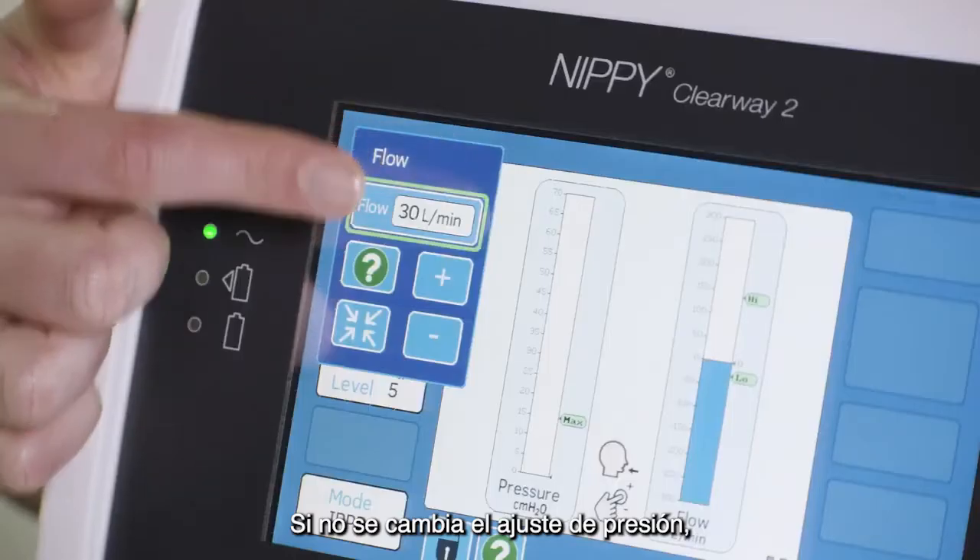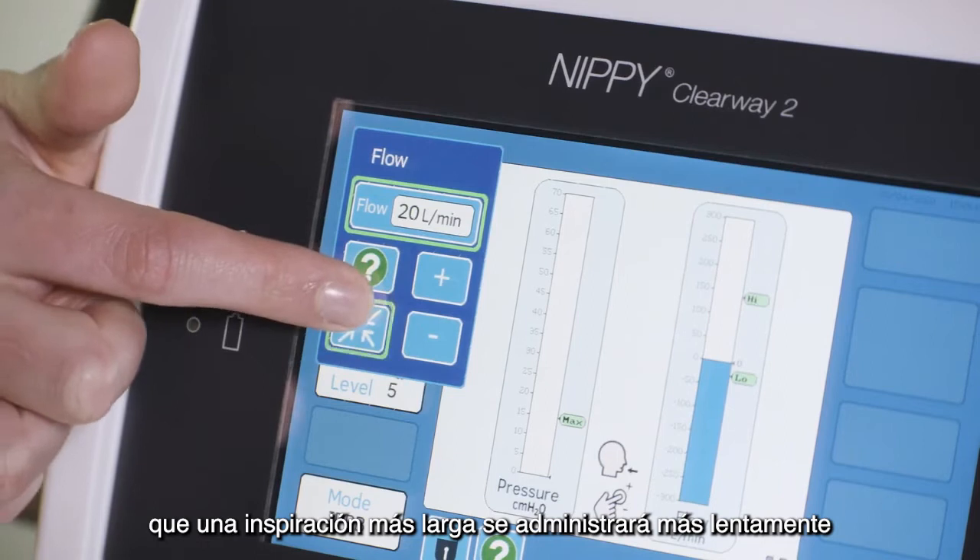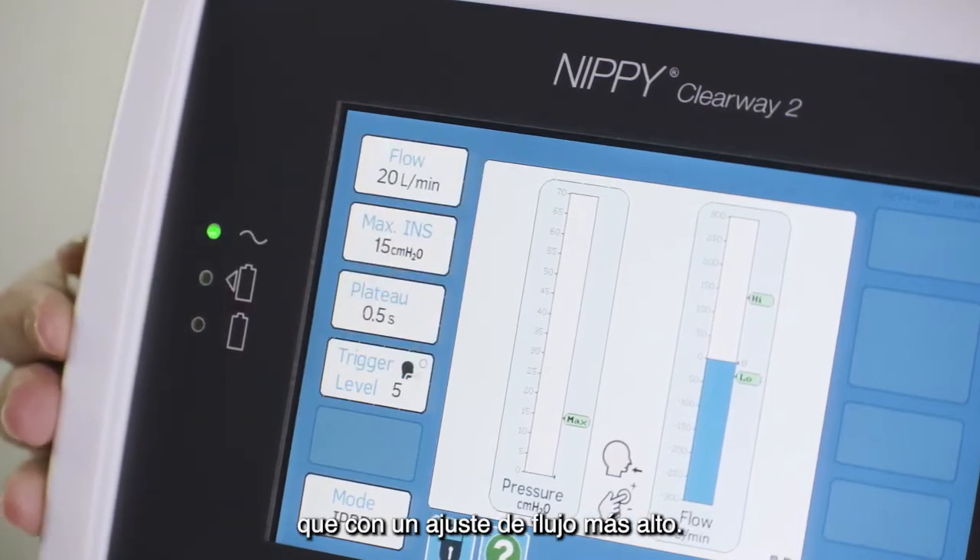Not changing the pressure setting but decreasing the flow setting will mean a longer breath will be delivered more slowly than with a higher flow setting.